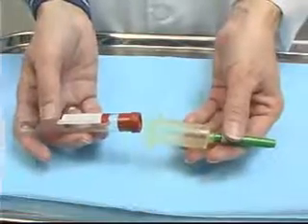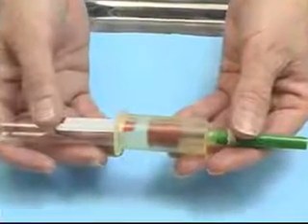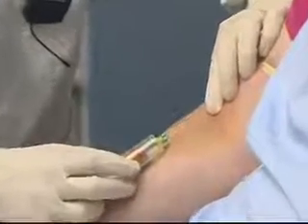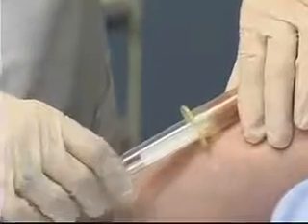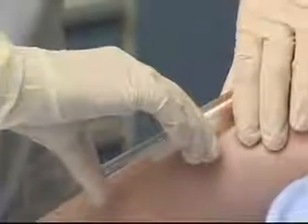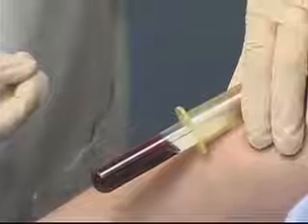I'm going to rest the blood collection tube inside the vacutainer holder just abutting the end of the tube to the needle. I'm going to remove the protective cap from the needle — noting that I'm going bevel up — and at a very small angle I'm going to insert the needle through the skin and into the vein. I'm now going to change the position of my left hand so that I'm steadying the vacutainer holder, and that enables me to push the tube into the needle, creating the vacuum and allowing the blood to flow.